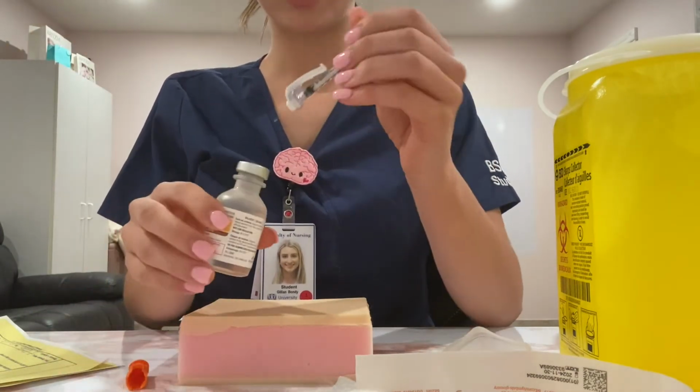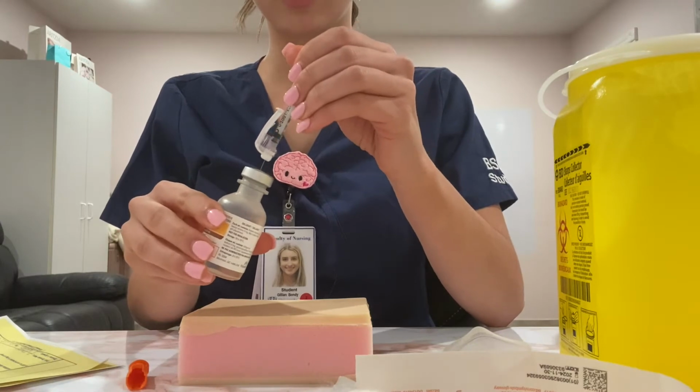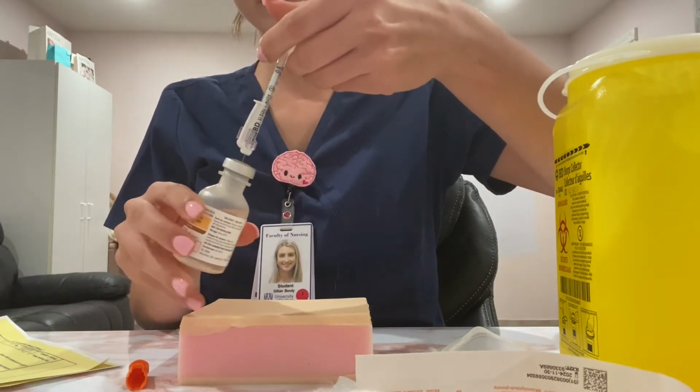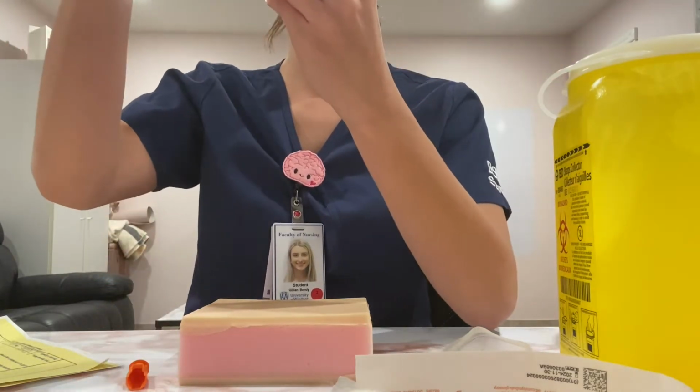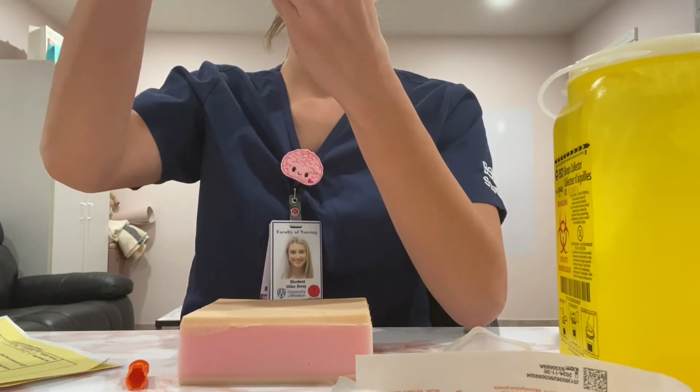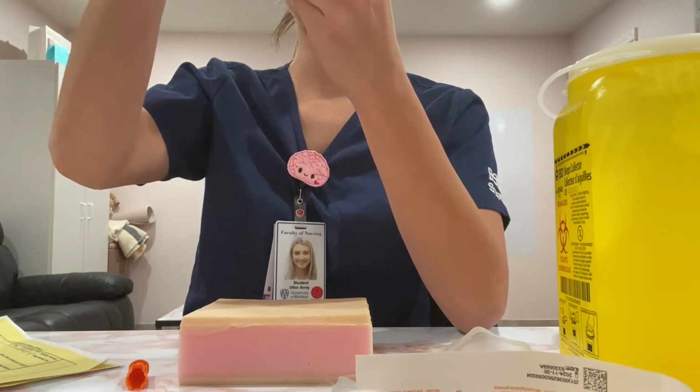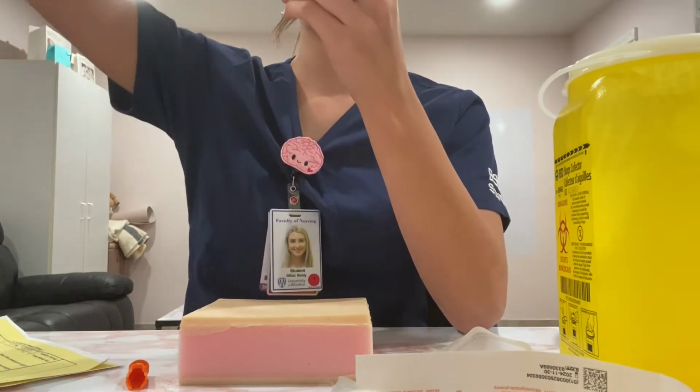And then I'm going to inject the air, flip it upside down, and then pull back the 4 units.